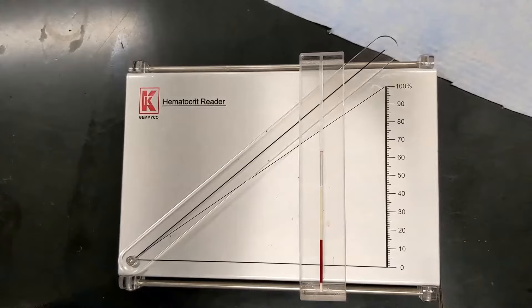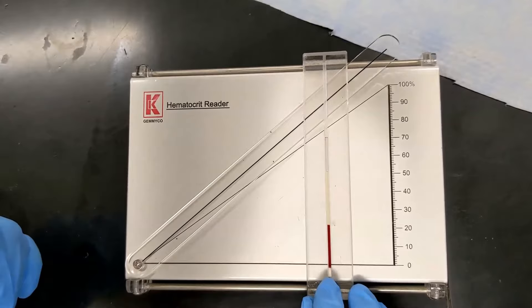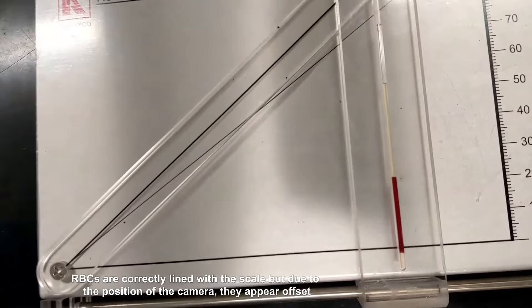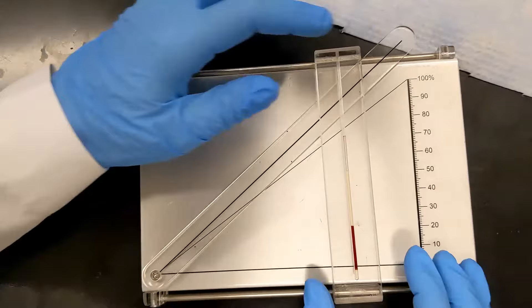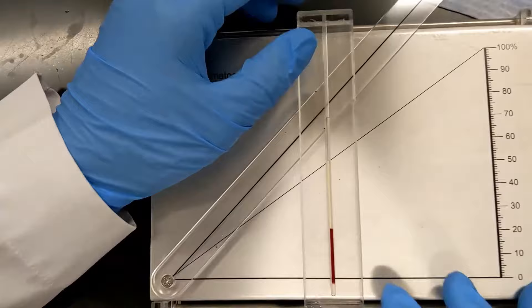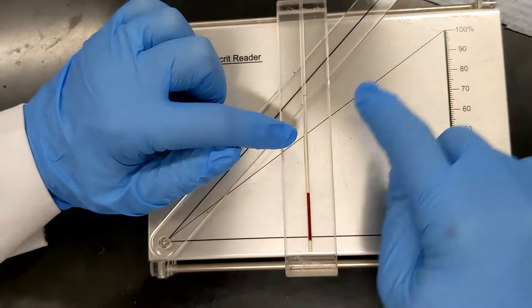You want to place the beginning of red blood cells where it says zero, so you're not accounting for the clay in your reading. And you're going to place this line you see right here at the plasma level. Make sure you match where the plasma is with the line. Zero is where the red blood cells start, and 100% here is the total blood.